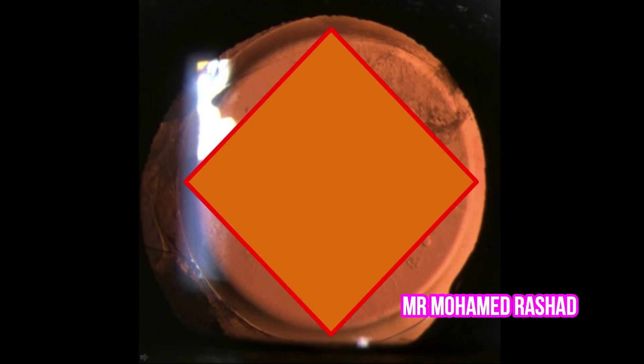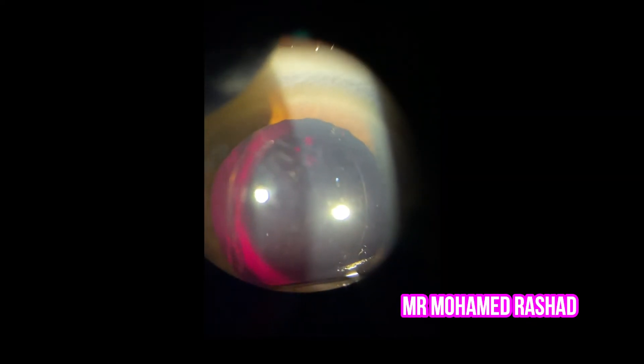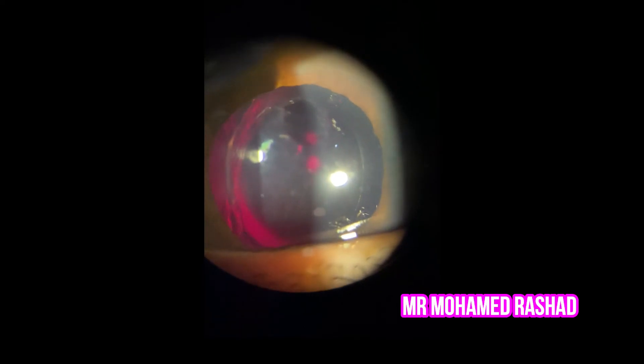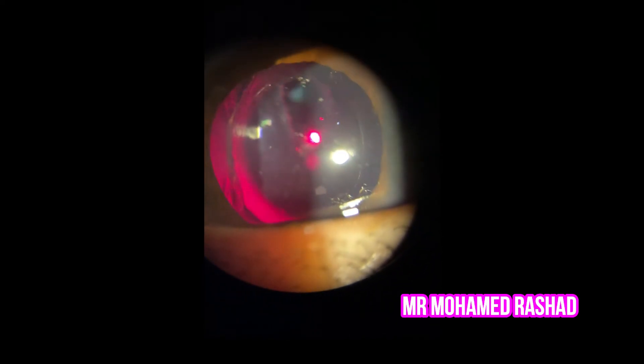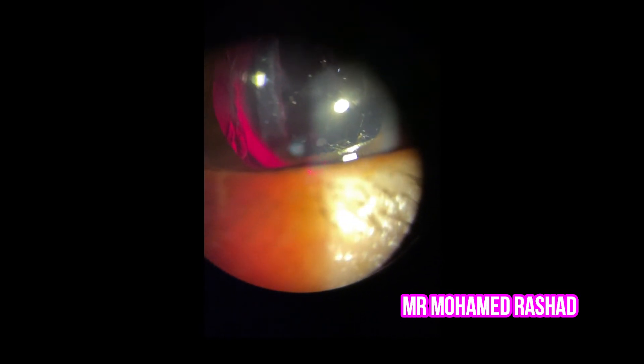At the end you will have a diamond-shaped opening, which helps the visual axis avoid any flaps — unlike the circular technique. This patient doesn't need a contact lens. We start the superior part at 12 o'clock; the most important thing is to adjust the focus to be posterior by about 150 microns.